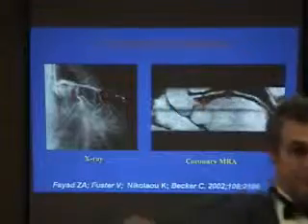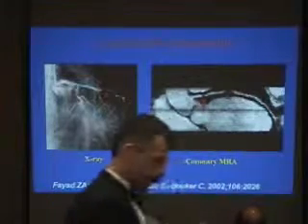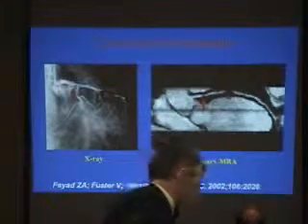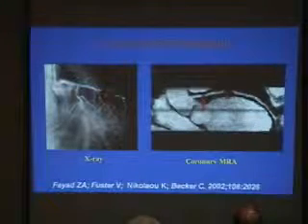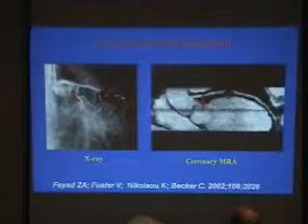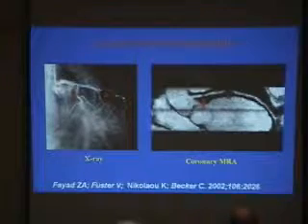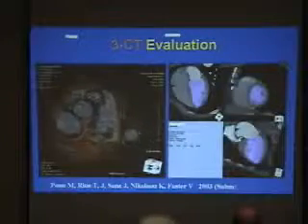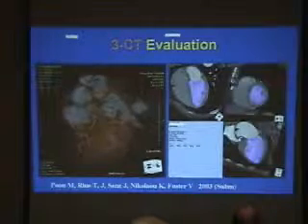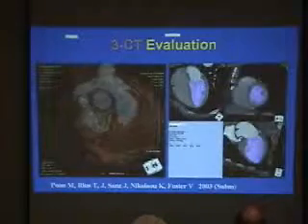CT will do much better. However, if you want to characterize the tissue in the coronary arteries, CT is not good, MRI is very good. So let's be sure that we distinguish between where the narrowings are and let's characterize a lesion. From the point of view of MRA, I'm not entirely sure it is going to make it in the coronary circulation with injection into the vein or without injection, but certainly in the systemic circulation it will. Second, I said calcium score, MRA for the systemic circulation, now CT for the coronary circulation.